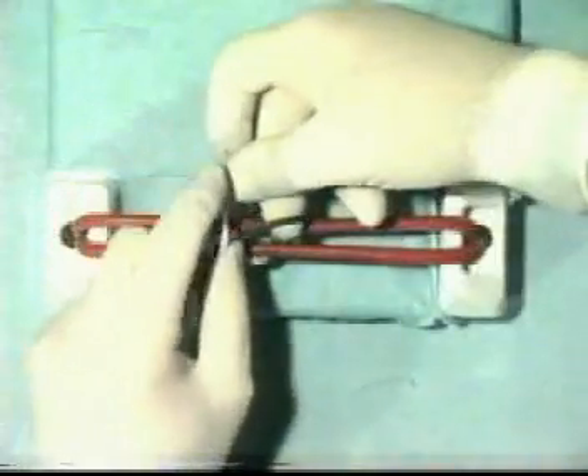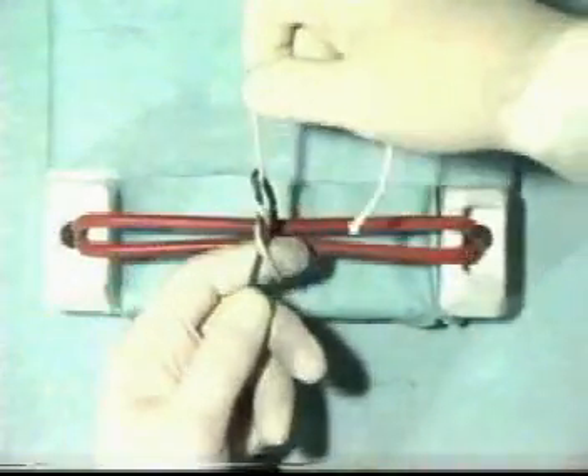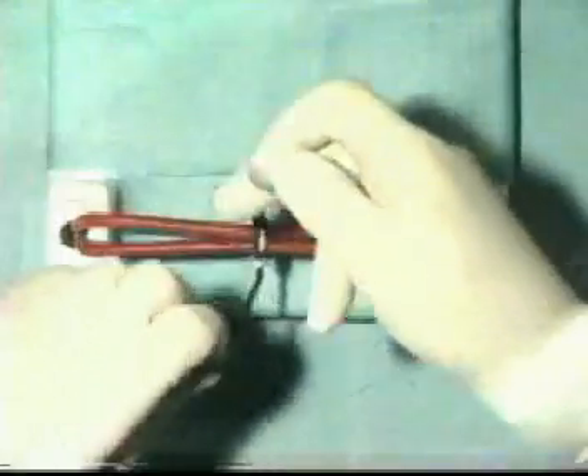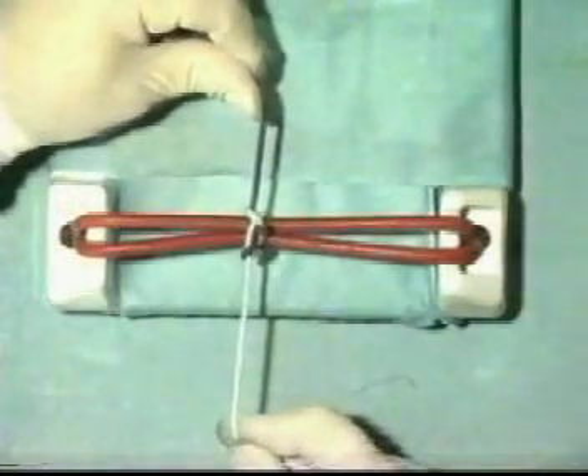Occasionally, we want a knot which is secure and will not slip even with one throw. Therefore, we can tie two throws, as seen here, and snug that down, and then return by two more throws. And although we don't have a very pretty-looking knot, we have a very secure surgeon's knot.